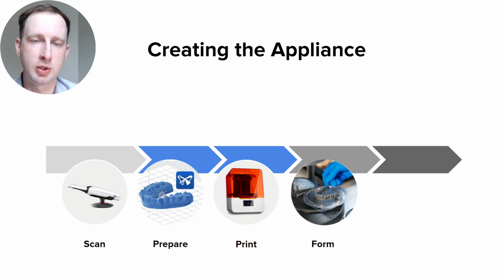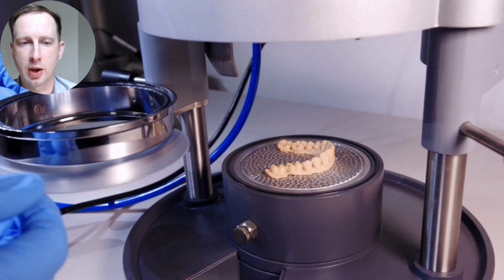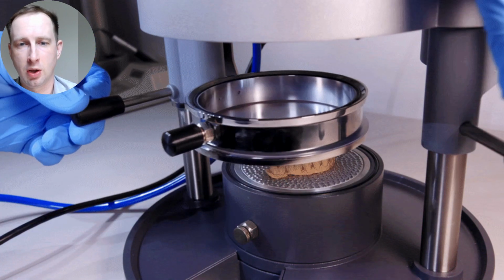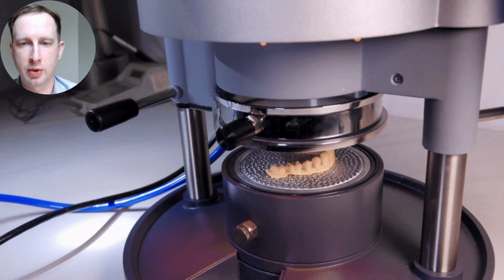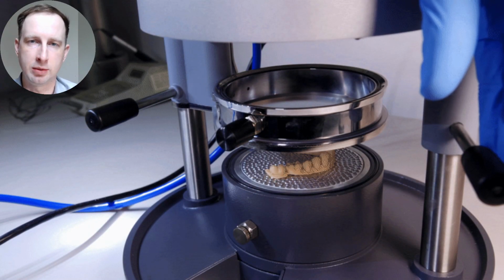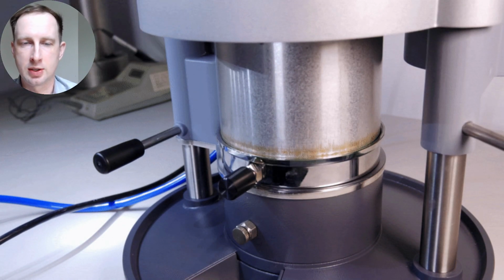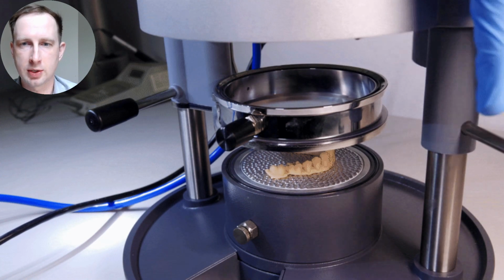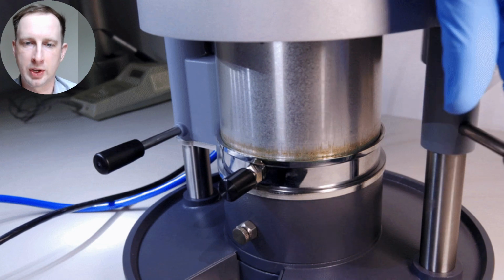Now comes the actual appliance fabrication. So we use a Drufomat pressure former, which I highly recommend, pressure forming over vacuum forming. But really, fundamentally, what this unit does is it heats the sheet of plastic, of varied heights. So, these sheets come in as thin as 0.6 millimeters, and I personally like a 1 millimeter thickness for my appliances, retainers, and even aligners.